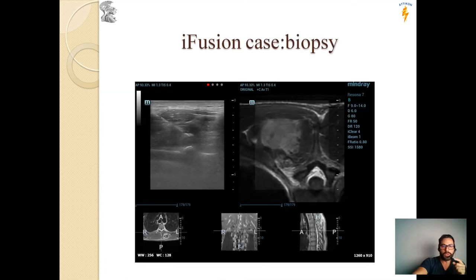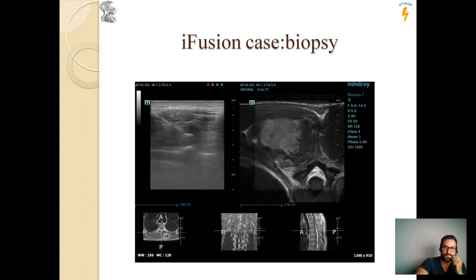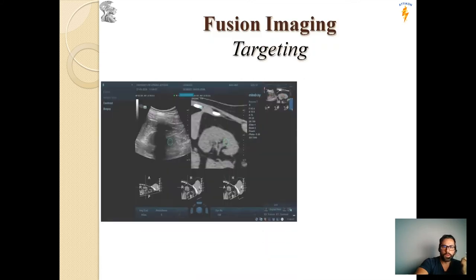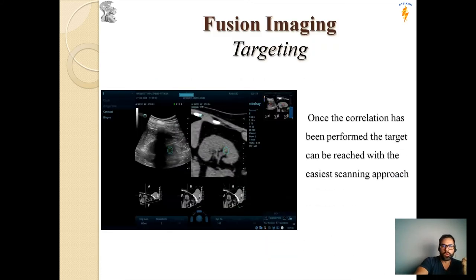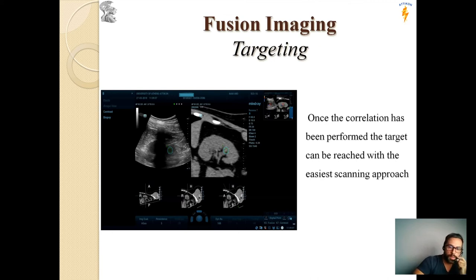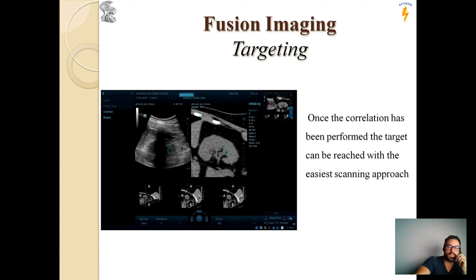You can see in the first picture our needle in the center of the lesion. In the second picture is an MRI image. Once the correlation has been performed, the target can be reached with the easiest scanning approach, even in hard cases such as biopsies of the kidney.